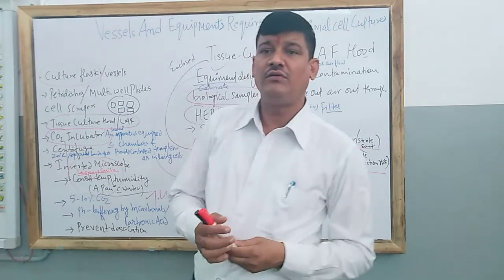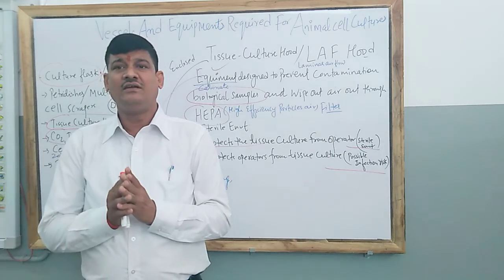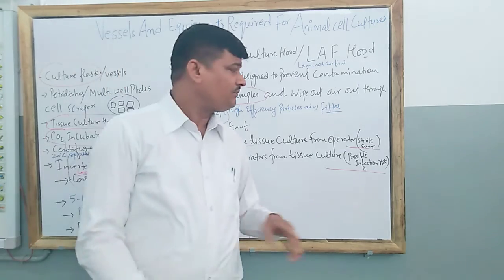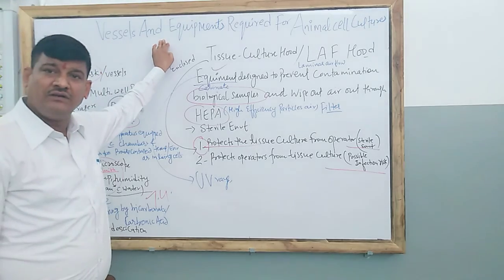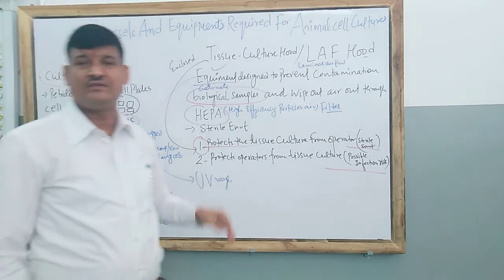So this is all about the basic nutrient medium, conditions, and equipment required for the culturing of animal cells.